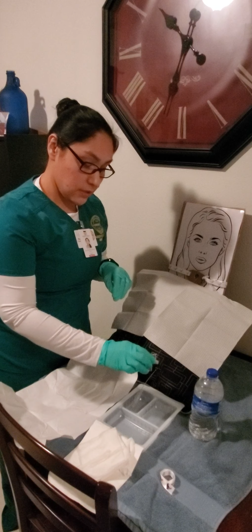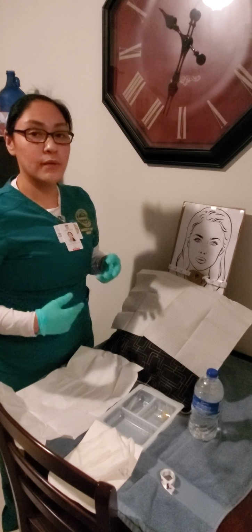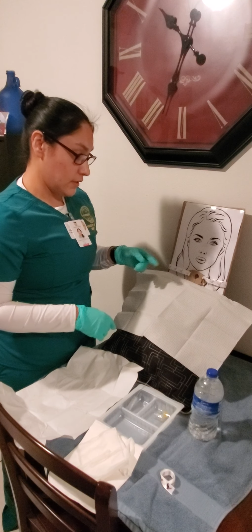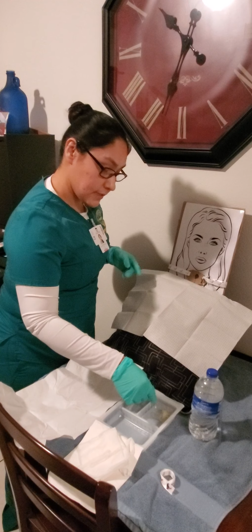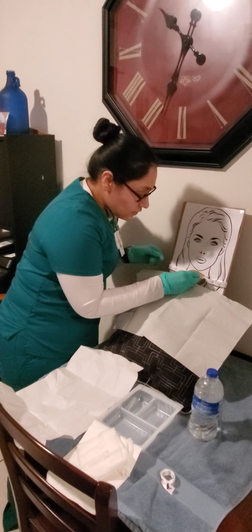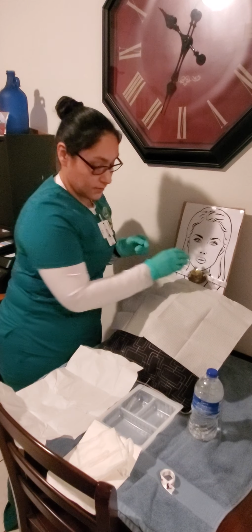Okay, once you're done cleaning, you can go ahead and place the cannula in the second tray with the normal saline so it can rinse. Okay, so once it is rinsed, you can go ahead and replace it with your dominant hand. So I'm going to go ahead and insert it and make sure that it locks.